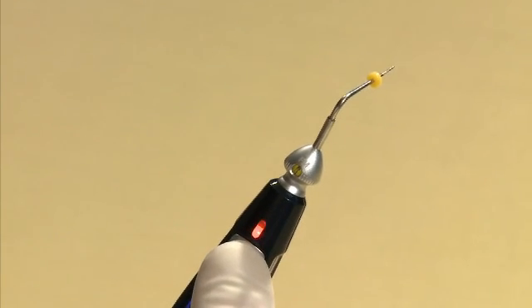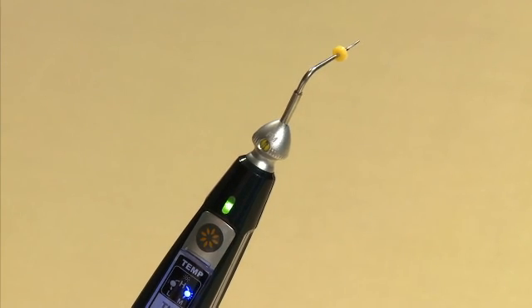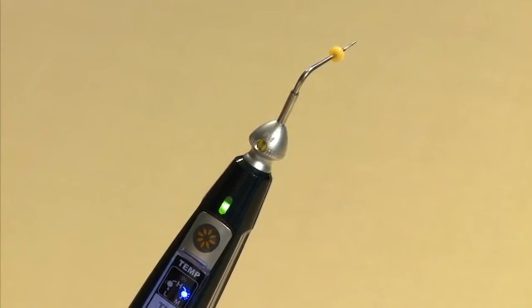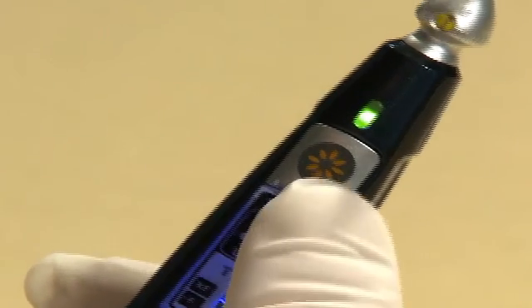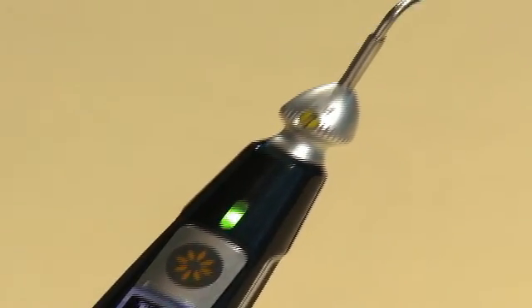Pressing the operation button will initiate the pen tip to heat up. Releasing the button will stop the heat and the pen tip temperature will cool down. A beep will sound to signal that the tip is heating up.